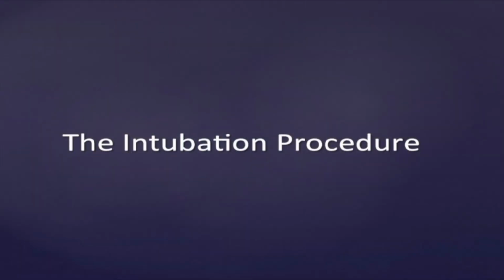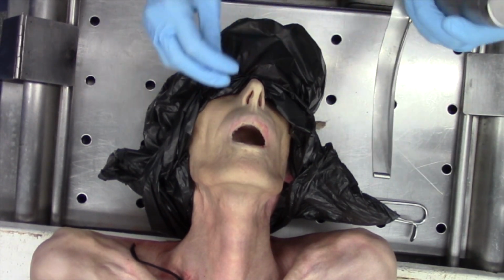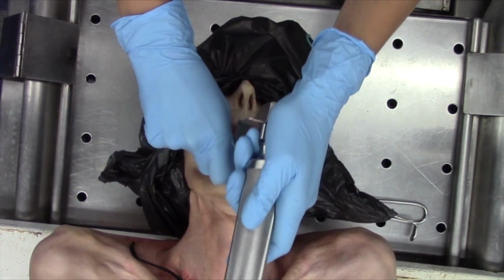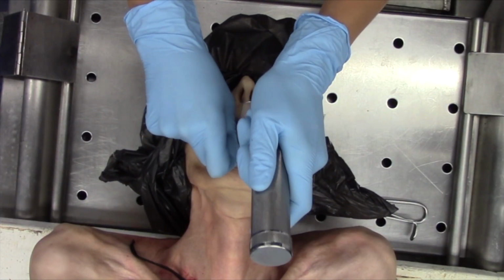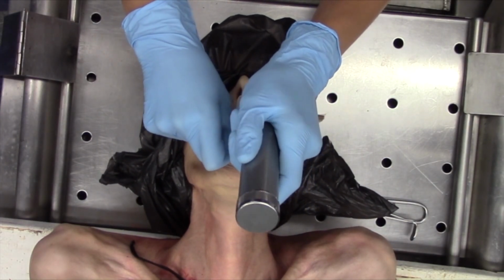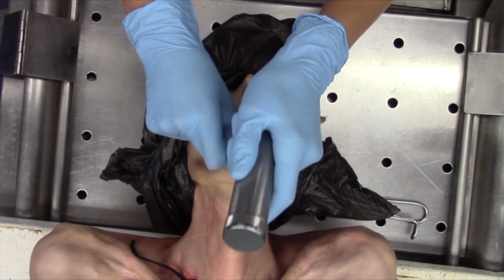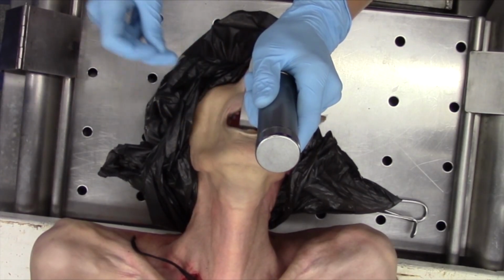We now demonstrate the intubation procedure using a donor cadaver. So we have our MAC 4 blade. I'll insert the blade into the patient's mouth. I advance the blade until I am in the vallecula, and I lift upwards to move the epiglottis out of the way until I see the cords. Okay, and I see the cords.